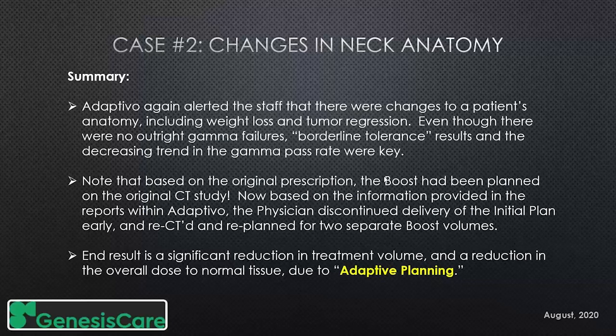Sure. Yes, there is an adaptive mode within Adaptivo, and there are customers of ours that are using the adaptive mode. It does, in fact, calculate the daily cone beam CT with deformable image registration.